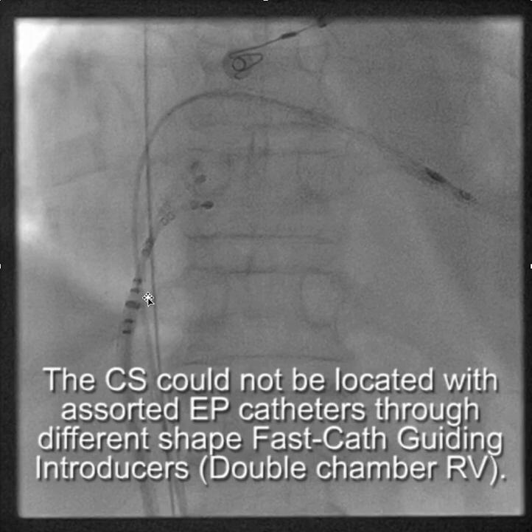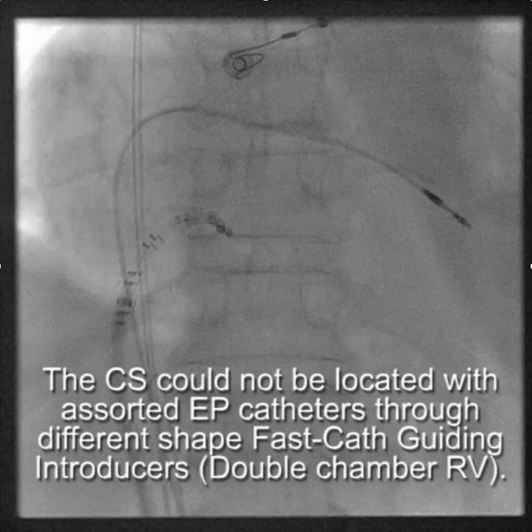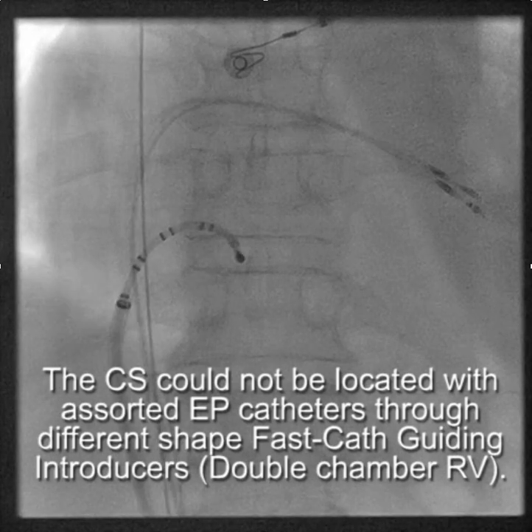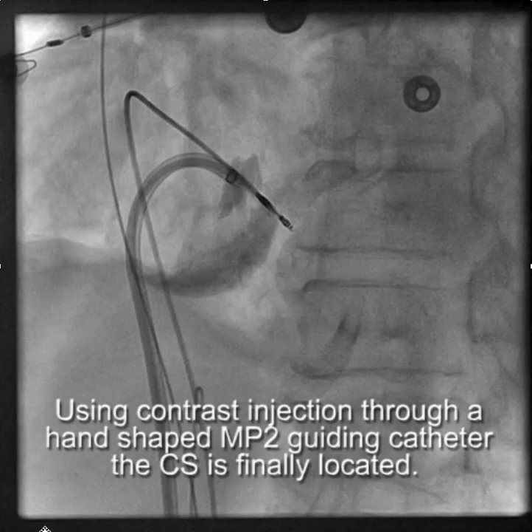We started using an EP catheter and an SRO fast cath guiding catheter. We kept looking and couldn't find the coronary sinus using the EP catheter, so we went to contrast injection through a hand-shaped multipurpose catheter, and eventually we were able to find the CS.